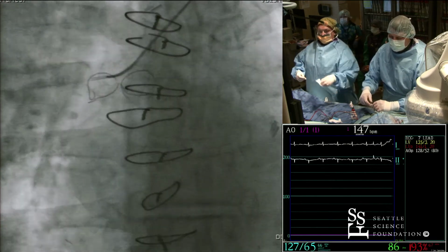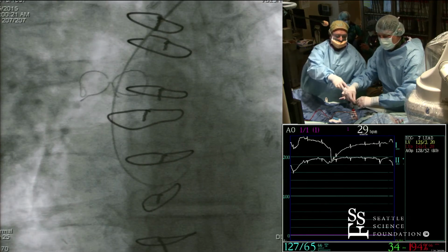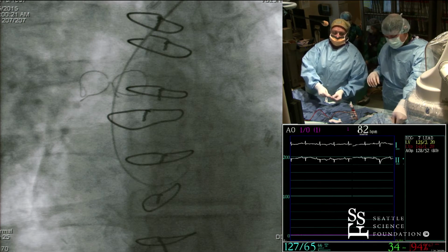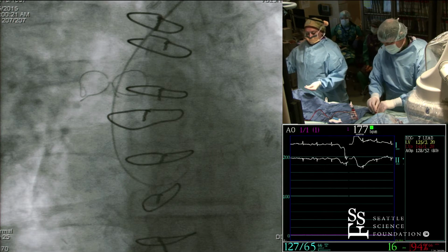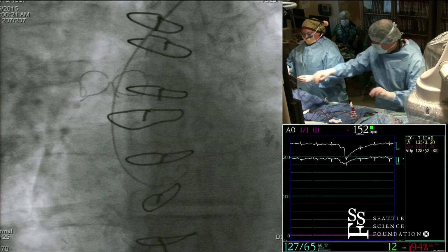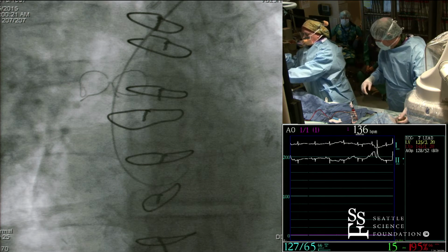How old is that graft, John? 2007. So that right graft was occluded, obviously. That's why I looked at the right there. The right is a CTO that's potentially doable if necessary. We're not going to do that in preparation for the vascular surgery, but if the leg gets repaired and all of a sudden he's symptomatic, then we've got something to think about.